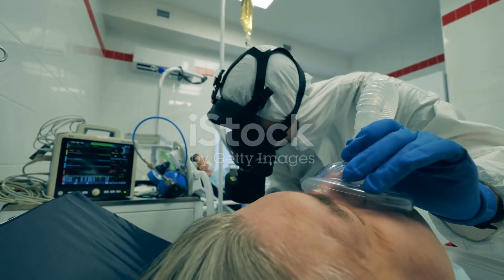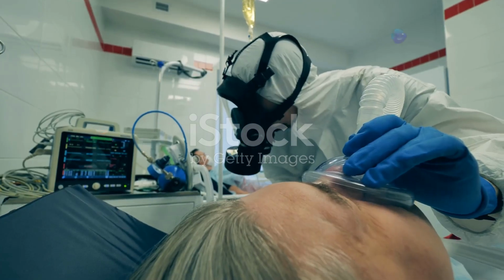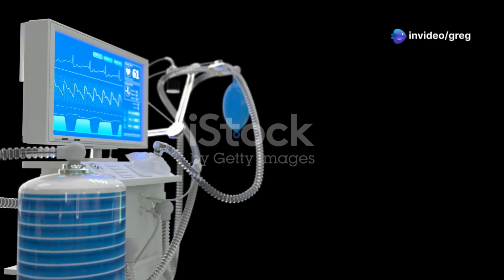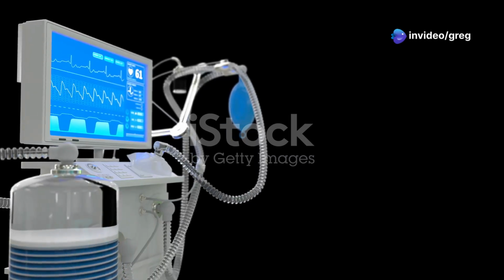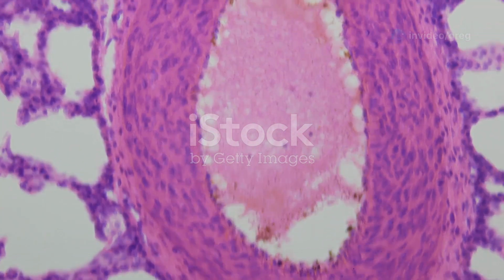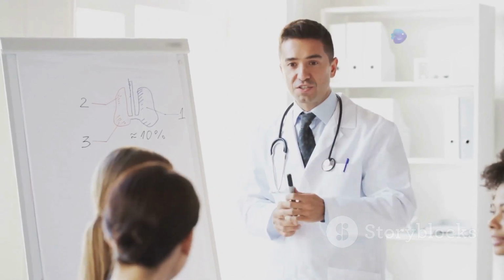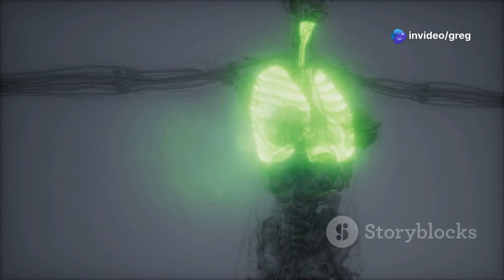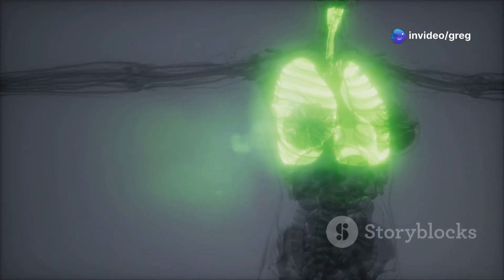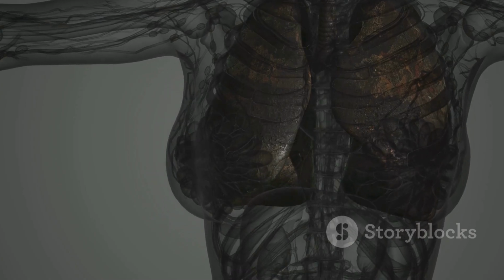Mechanical ventilation, while life-saving, can harm the lungs if not carefully managed. The pressures generated during mechanical ventilation differ from the physiological pressures in normal breathing. These unphysiological pressures can damage the delicate structures of the lungs. Two key pressures are important to understand: transpulmonary pressure and pleural pressure. Transpulmonary pressure is the pressure difference between the inside and outside of the lungs. It is the force that inflates the lungs.